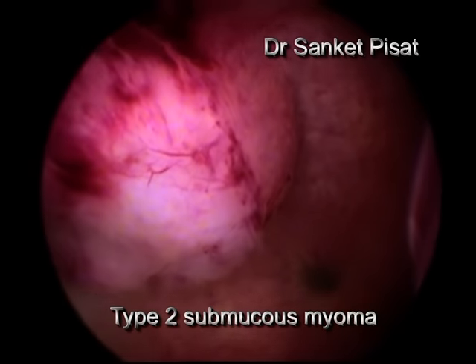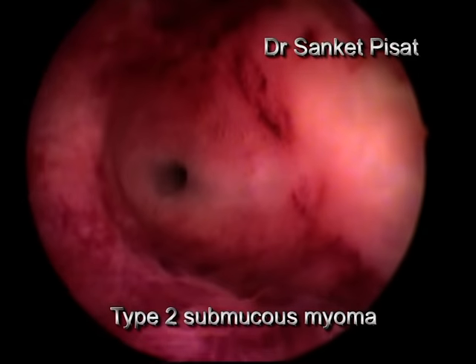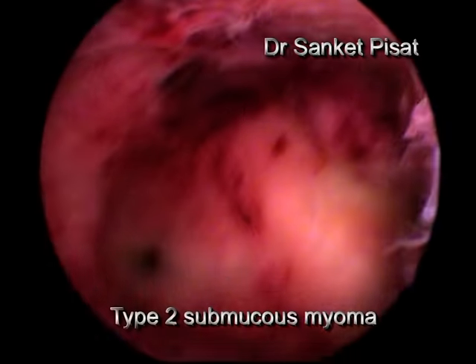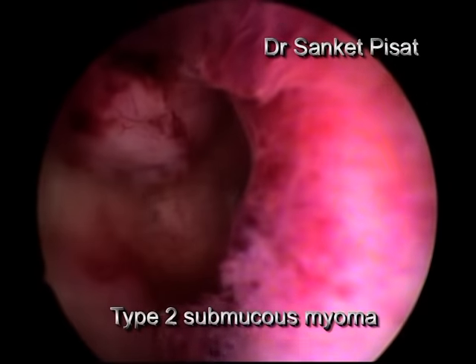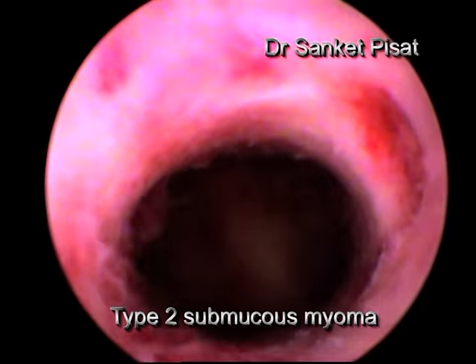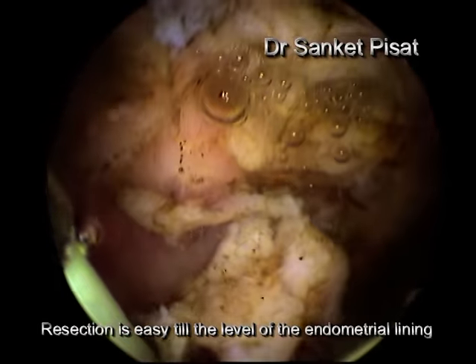This is a patient with a type 2 submucous myoma, partly projecting into the uterine cavity and partly located in the uterine wall. Cursory examination shows the rest of the cavity to be normal without any apparent pathology. Resection is started and is easily continued up till the level of the endometrial lining.